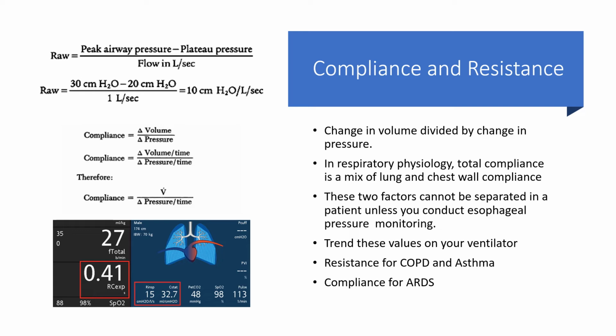So the point I want to make here is that measuring compliance and resistance is really important based upon the condition of the patient. If you want to see if they're getting better over time, trending is a very important tool. Part of my education with my staff was that they knew how to trend things perfectly. When I worked as an ICU therapist, if I had a patient in ARDS, I would trend their compliance over days. I knew if they were getting better or worse.